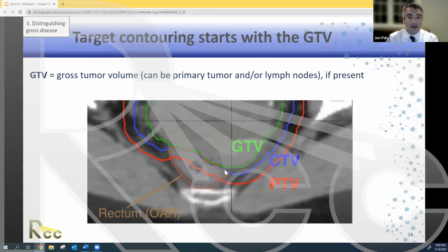And we've decided based on our imaging and our exam that this disease does not invade the bowel, the rectum. And so we're contouring the GTV based on the fascial planes here and not expanding it into the rectum here, which we feel is uninvolved.